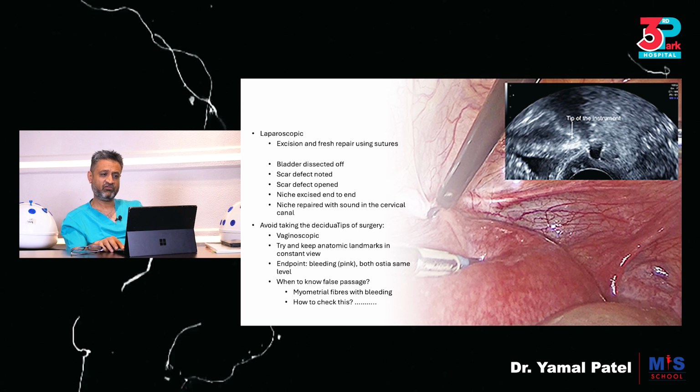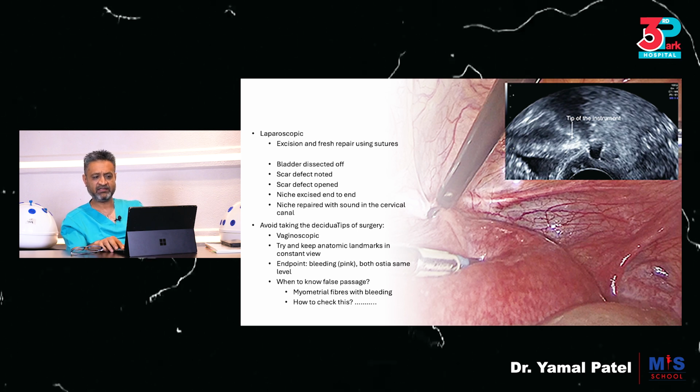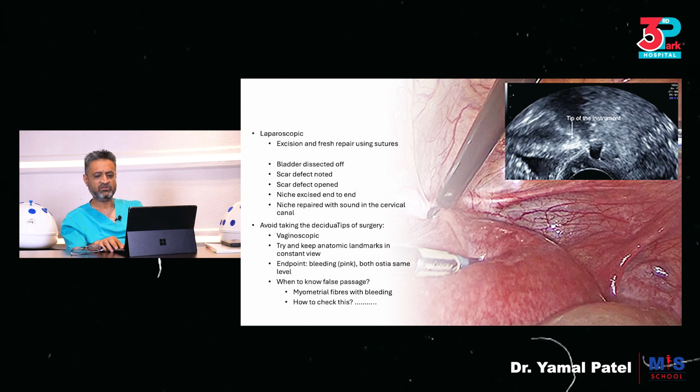Avoid taking the decidua during the steps of surgery. Avoid taking the decidua. Do it vaginoscopic if you're doing it hysteroscopically.